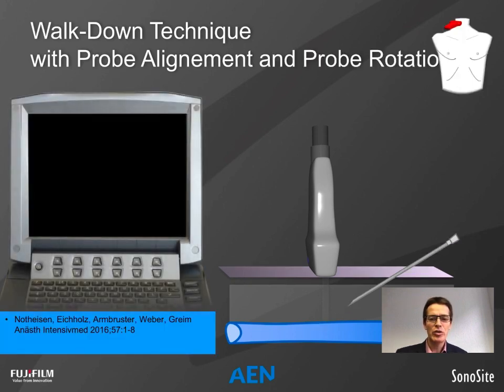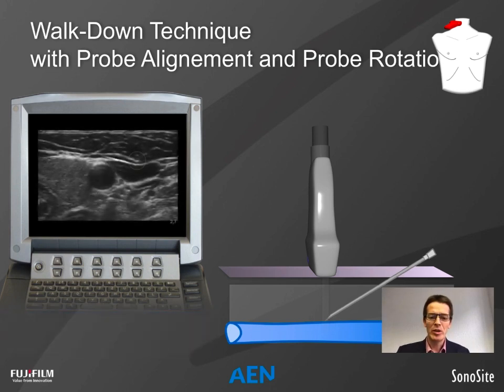So coming to the last procedure, where we think it is the safest and the best and the one you will have most fun with. This is the walk down technique with probe alignment and probe rotation at the very end of this procedure. The beginning is exactly the same as in the method shown before. We just show the last step here on how to get to the 12 o'clock position. And now you don't keep on going with the needle and complete the procedure.